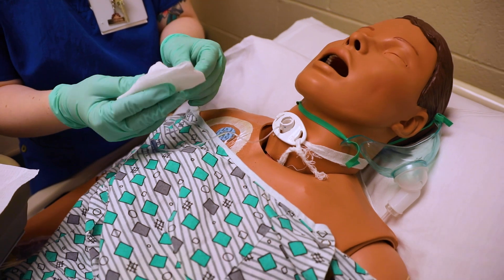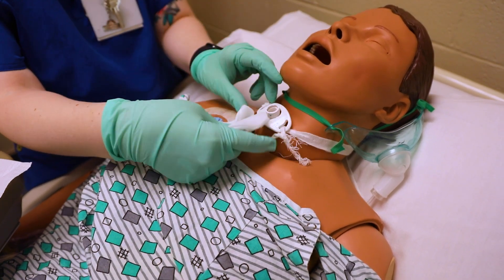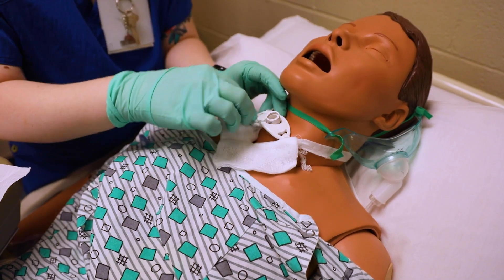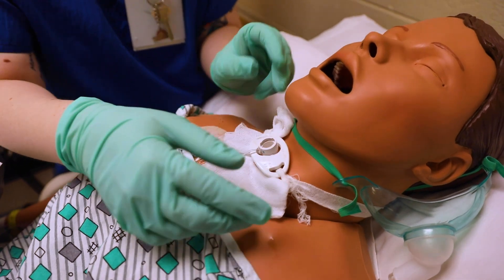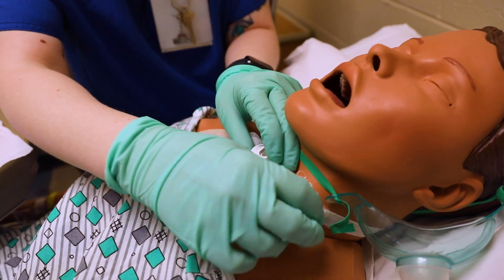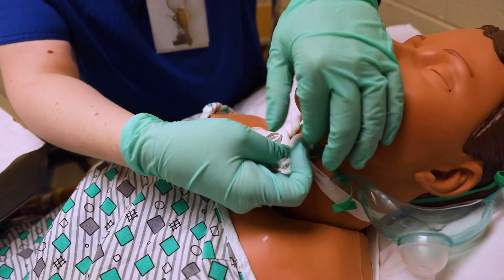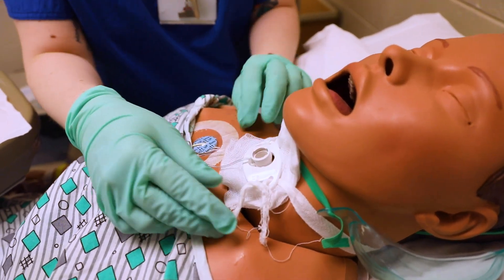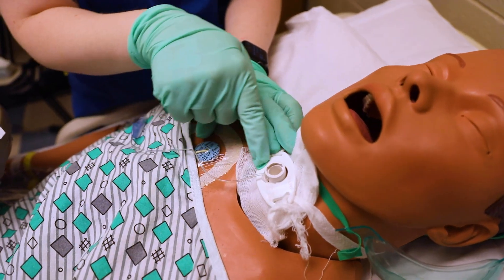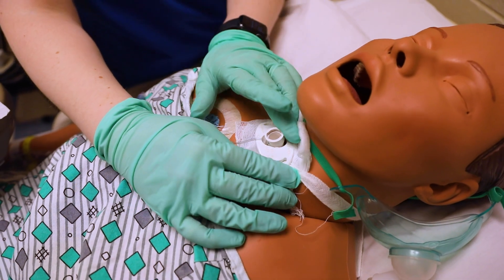When that's complete and dried, here's the trach dressing — it's just a split four-by-four. I'd place it like so on the patient. If your gloves are contaminated, change them right before this. I like to put it where the gauze is sticking up, because if secretions come out of the patient they'll drip down the chest rather than pool at the stoma. Now I'm going to go ahead and change the trach ties.